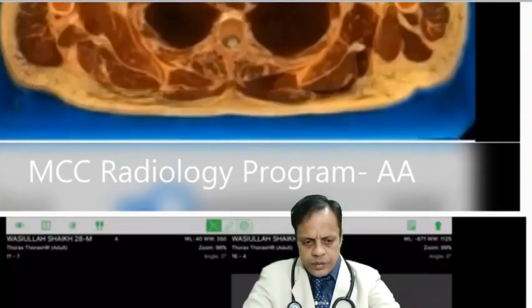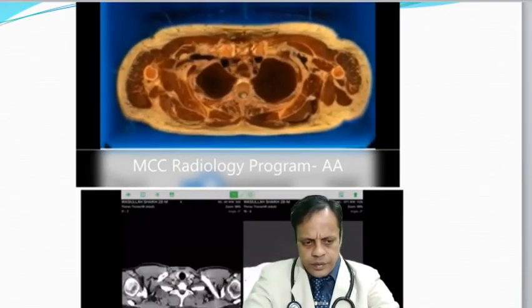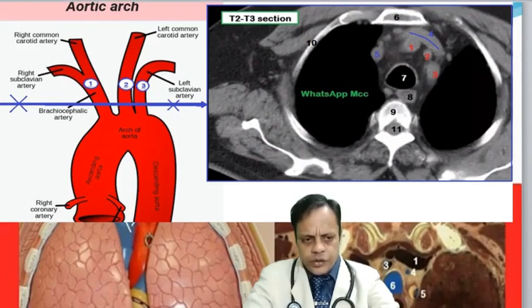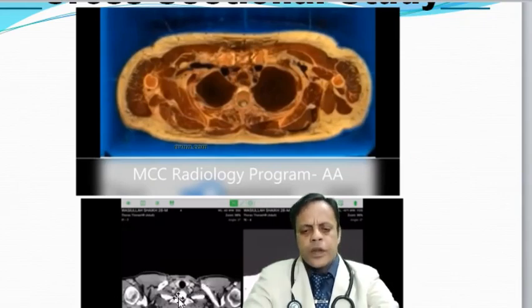So friends, here I want to give you a comparative study with CT scans. This is how we teach. Here you can see the mediastinal window, and these are HRCT. We will be dealing with this part only.